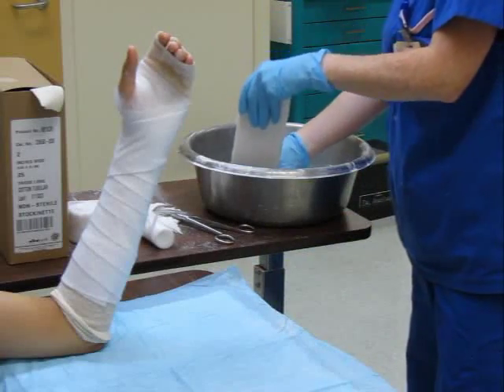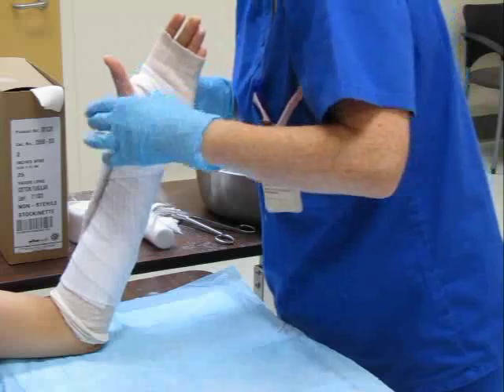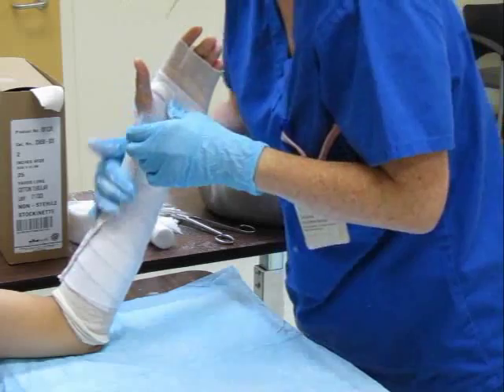Wet the notched plaster slab and apply it to the dorsal surface of the forearm and wrist. The thumb should be accommodated in the notch, with the small plaster appendage doubled over and passed through the first webspace.